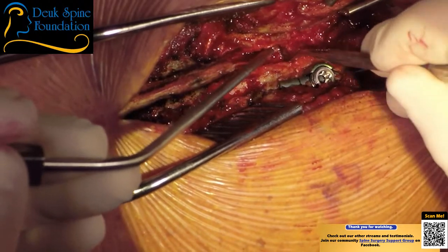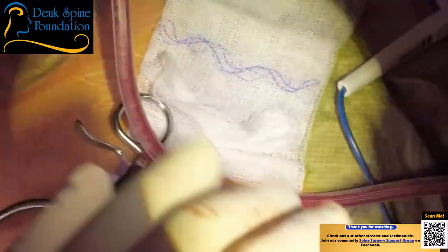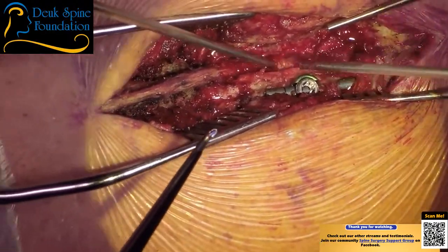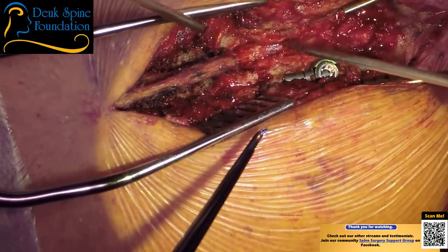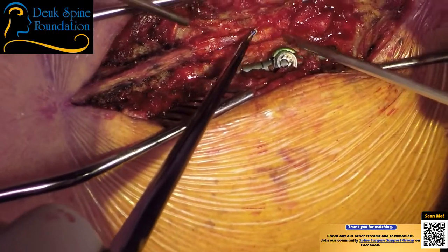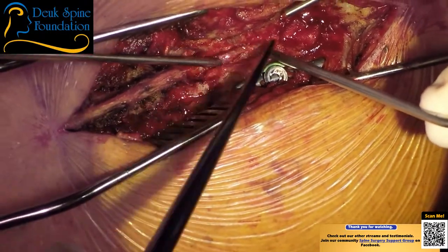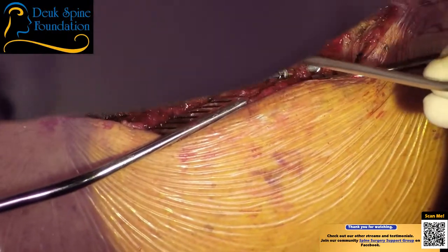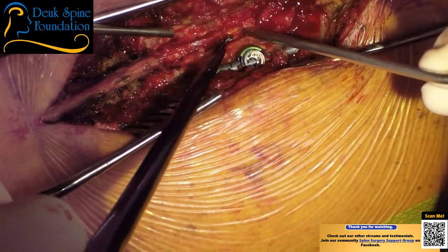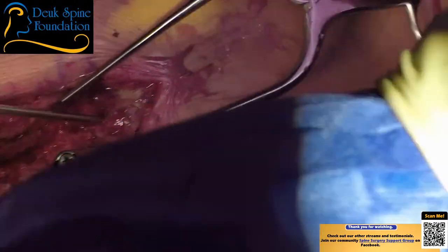You have a question? Yes, we do. I'm just taking this bone out, little piece by little piece, like literally millimeter by millimeter. I'll be happy to take it. Yes, we have a viewer on Facebook who's wondering, do you use compression plates and locking screws? Do I use compression plates? We're not. Did he ask about compression plates? Yes. So, we're not using any.